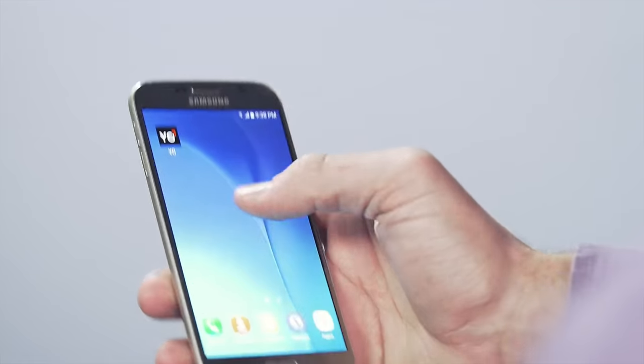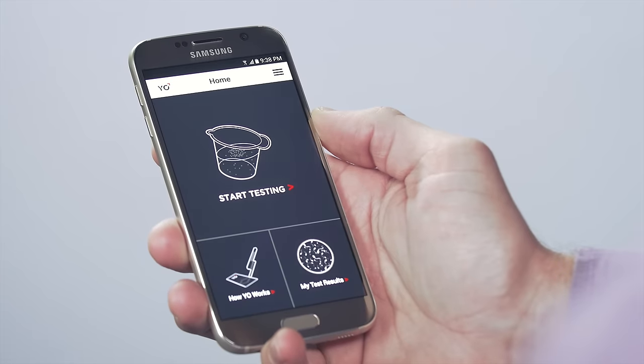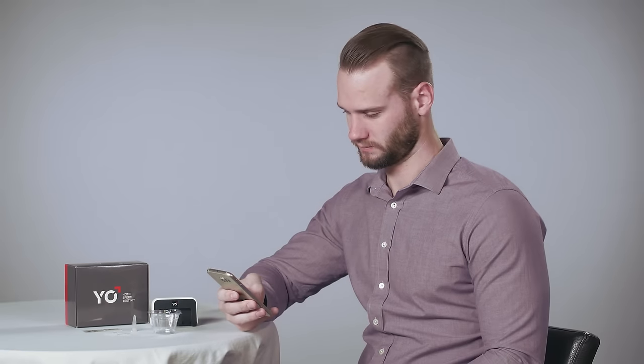Now, in just a few minutes, without any sperm touching your phone, you can run your own private, FDA-cleared Yo! home sperm test on your smartphone. Yo! takes a video of your sperm and checks your motile sperm count.